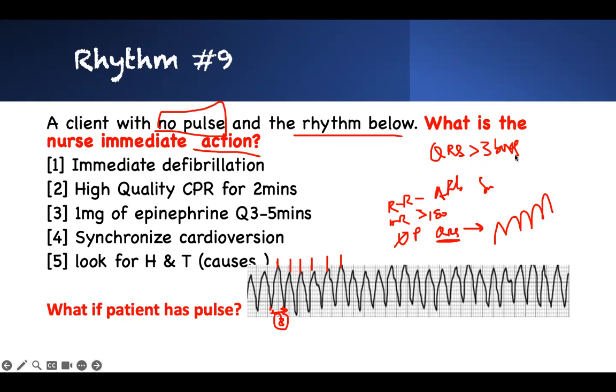In your description, when you see what we call wide QRS complex, this is what they're referring to. So we have a ventricular problem. I don't even see the atrium. So the ventricle is taking over the atrium. He said, I don't need any signal from you. So we have a ventricular problem that is fast. So tachycardia, ventricular tachycardia. And it's uniform.